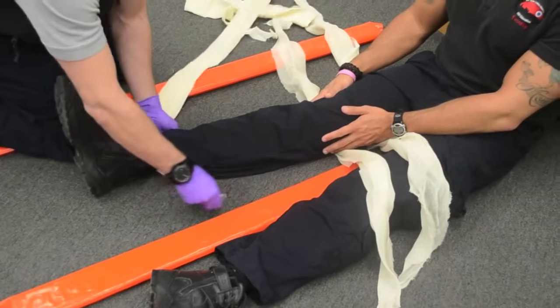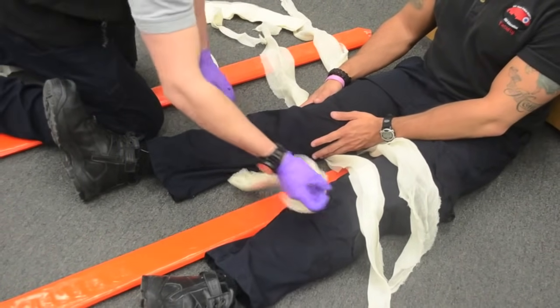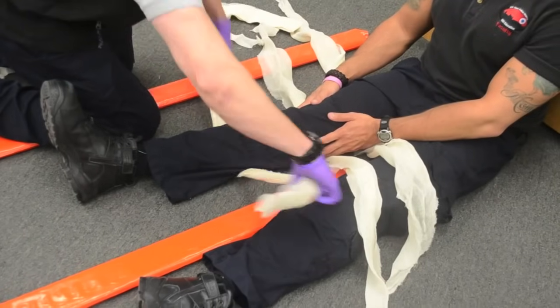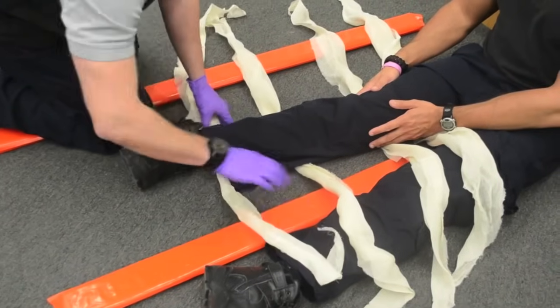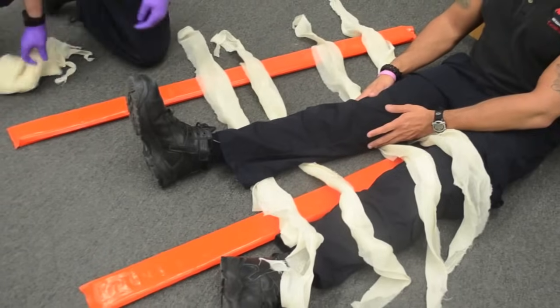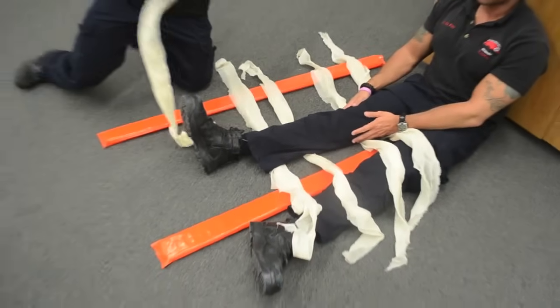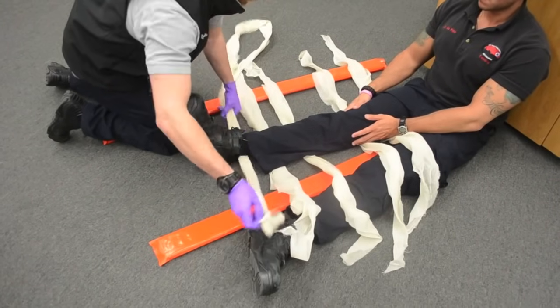Similarly, I am going to use the space below the ankle as a natural void. And I have one final one that I had tied together as the ankle hitch. We will just slide it into place.